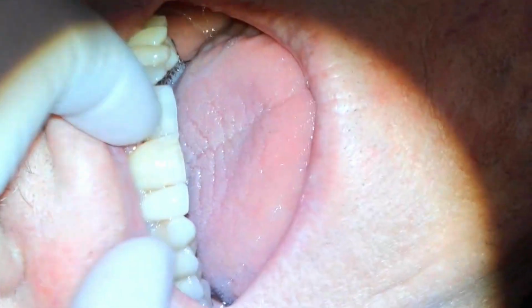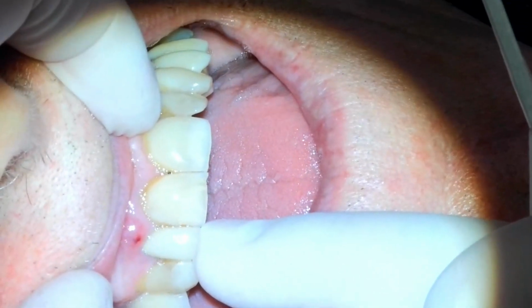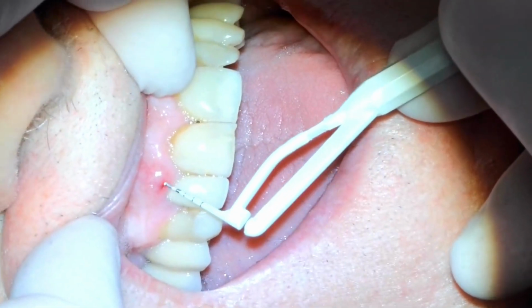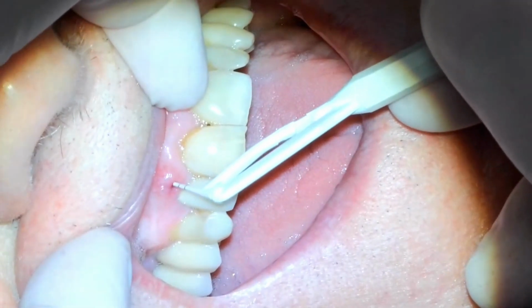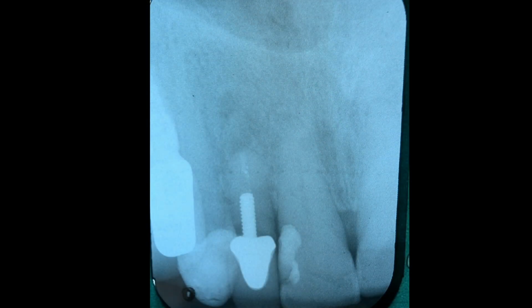Thanks for joining me today for this emergency visit. A person came in with a loose tooth with some swelling on the lip side of the tooth. There you can see I had popped it before. He had a big pimple there. I popped it before I turned the camera on. But it's basically a fractured root. And there's the whole tooth with the post, and then the infection space above it there.